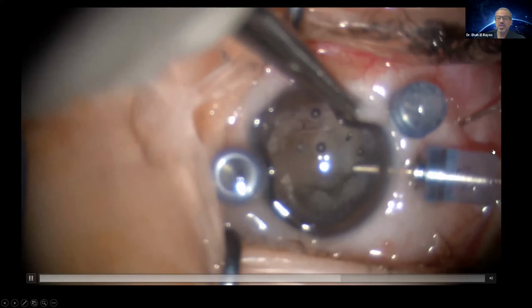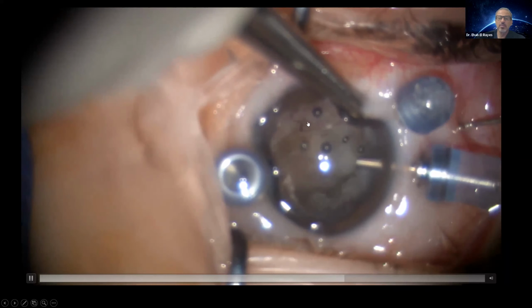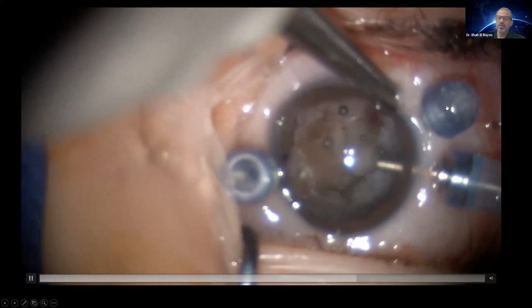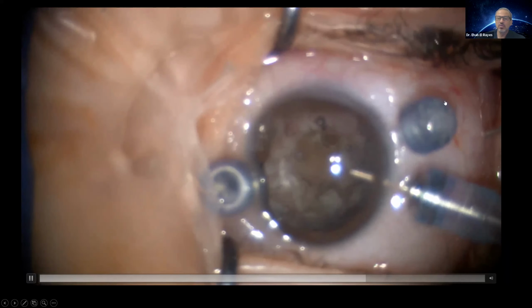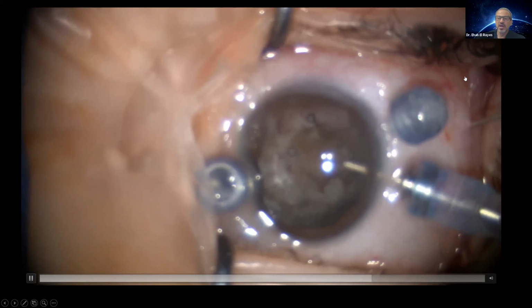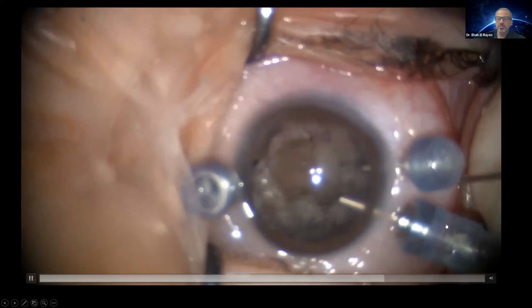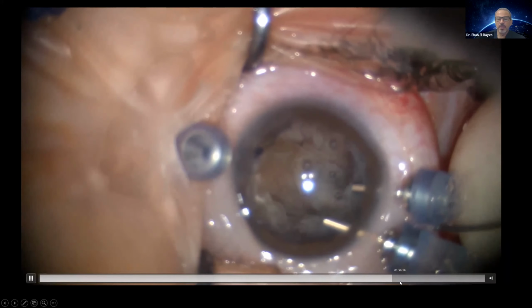So once you do that, it's actually blood. This is subretinal blood most of the time. And when you aspirate it, it starts opening up here. I will show you what's in the needle. I already aspirated it. Then I'm pulling it out of the eye. There, this is the needle right here. And this is the blood that comes out. Extensive dark blood with subretinal exudate. So it makes sense to remove it.